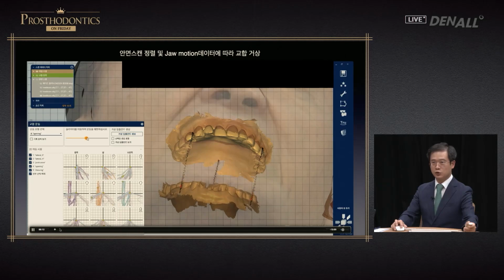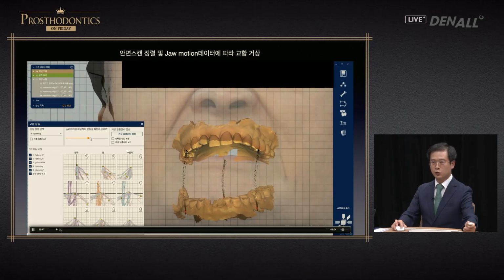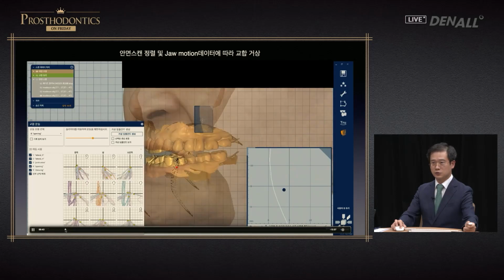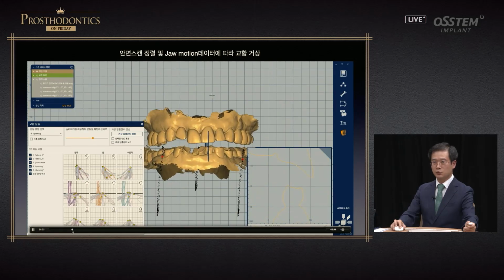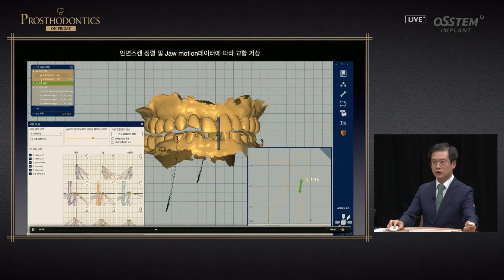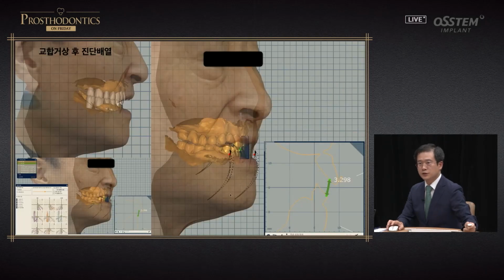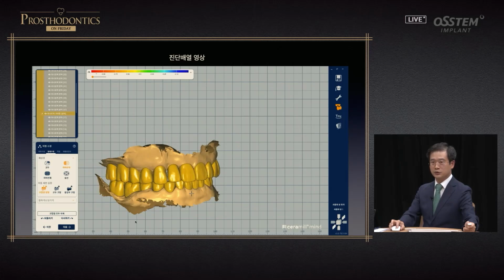In designing the prosthesis, as I proceed with analysis, the height and position are determined in an arbitrary manner. I determined the ideal position and space for the prosthesis. This is a very important prosthodontic step. The occlusal distance was determined to be 3.2 millimeter. I decided to increase the occlusion, and teeth alignment is done for treatment.